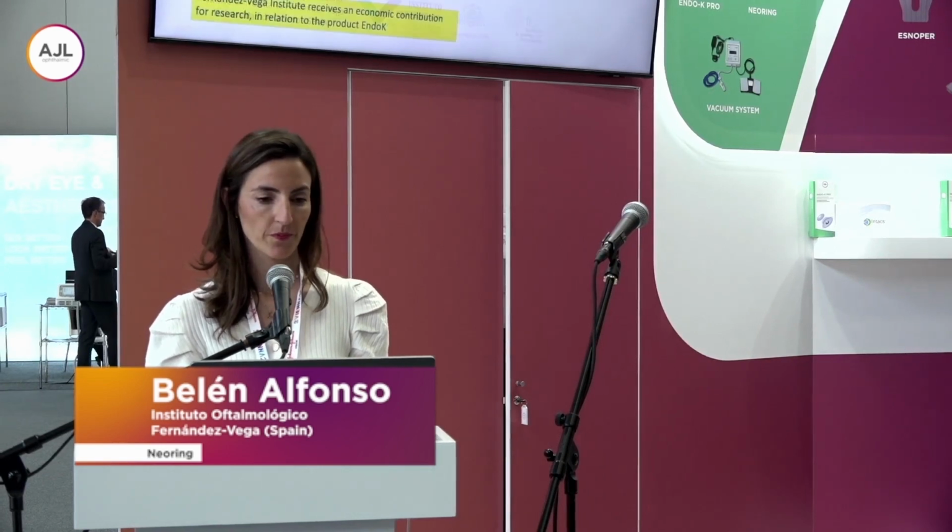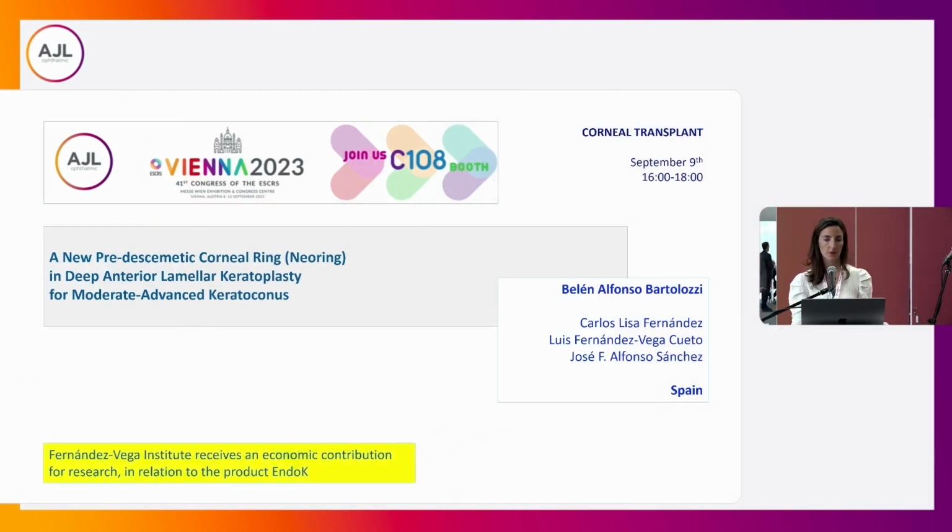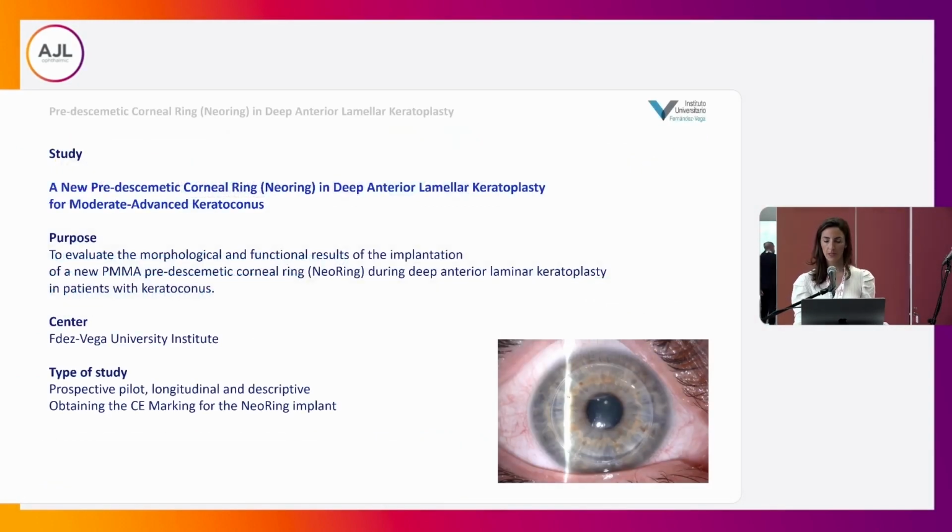Thank you so much for your kind presentation. And now we are going to start talking about a new pre-descemetic corneal ring called Neoring in deep anterior lamellar keratoplasty for moderate and advanced keratoconus. We are going to present this study, whose purpose is to evaluate the morphological and functional results of the implantation of a new PMMA pre-descemetic corneal ring during DALK in patients with keratoconus. This is a prospective study, and with this study we obtained the CE marking.